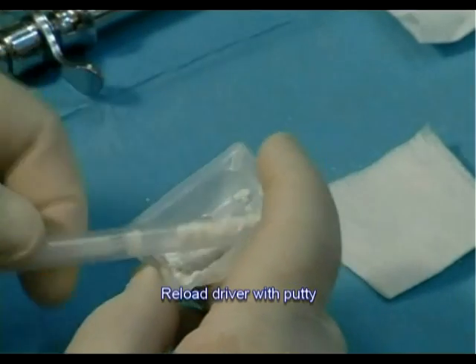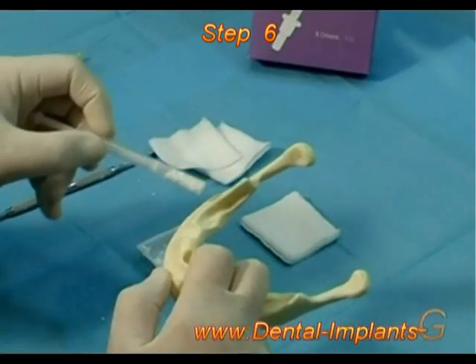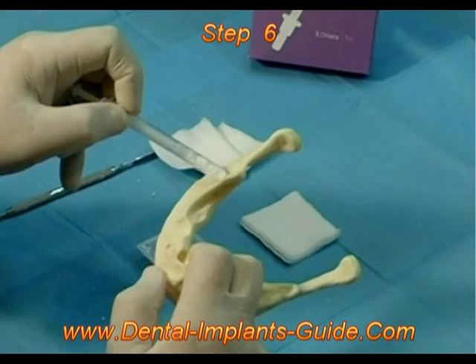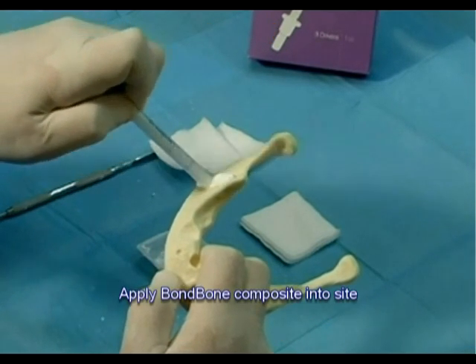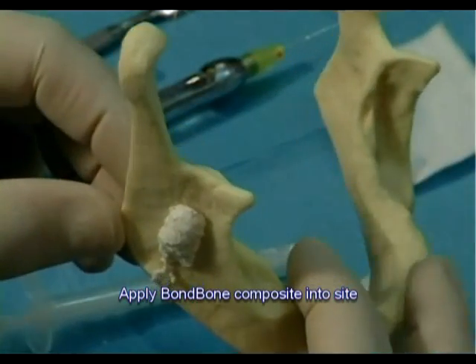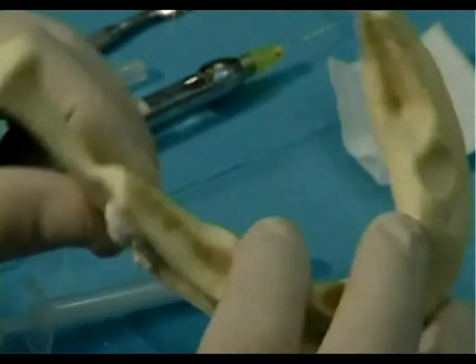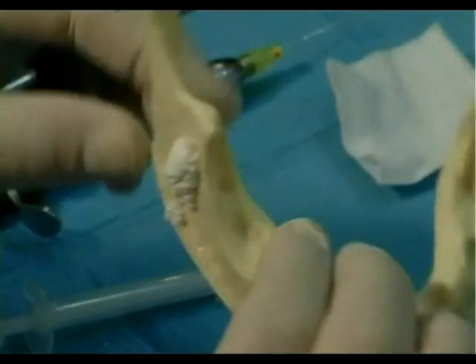Use the same maneuvers as loading amalgam to collect the putty. Step 6: Apply the Bond Bone composite graft into the required site by pushing the piston and ejecting the composite graft. The bone defect has to be entirely filled with composite graft in order to obtain good contact with natural bone.